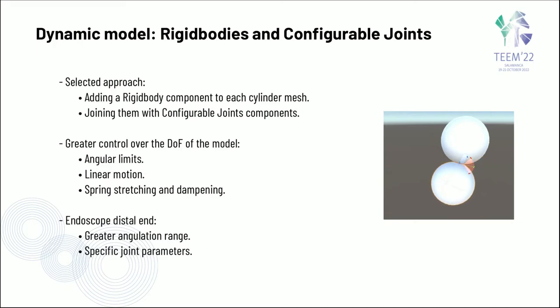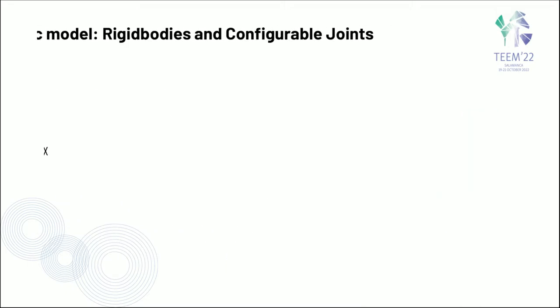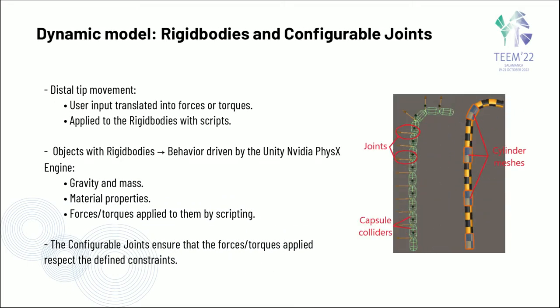Furthermore, a more specific parametrization for the distal end could be achieved, as it has a greater angulation range and is controlled by endoscope wires. For the movement of the distal end, user input is translated to forces and torques via a script and applied to the rigid bodies of the cylinders. As objects with rigid bodies, the cylinders' behavior is driven by Unity's wrapper of the NVIDIA physics engine, including gravity, mass, and impulses resultant of the applied forces and torques. The configurable joint ensures that resultant impulses respect the defined constraints, keeping the cylinders joined and maintaining the tubular shape.